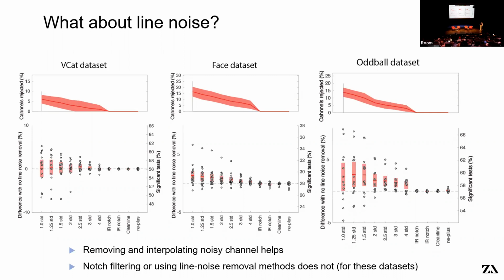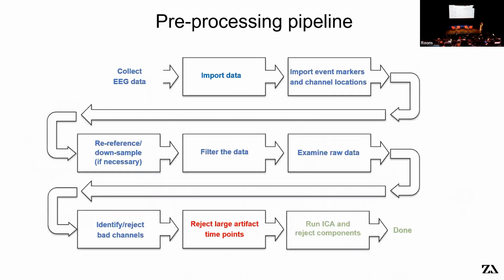I'm not sure why, but I think that sometimes a lot of line noise in one channel is because the channel does not have a proper connection with the scalp, so it's picking up a lot of noise. So removing those kinds of channels might really improve your analysis.